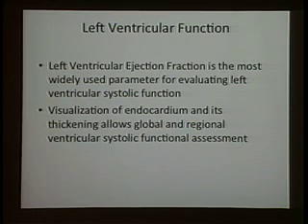So talking about EF, I think one of the major pieces of information we want to know when we're using the ultrasound is to determine how the heart is working. And we do this by measuring EF as a way to assess systolic function of the heart. One of the things you have to understand is you're looking for two major things: how the walls are moving, whether they're moving in or out, a lot or little, and whether the walls are thickening. A normal myocardium will move inward during systole and also will thicken. So it's important not just to see the movement, but also the behavior of the muscle as it contracts.